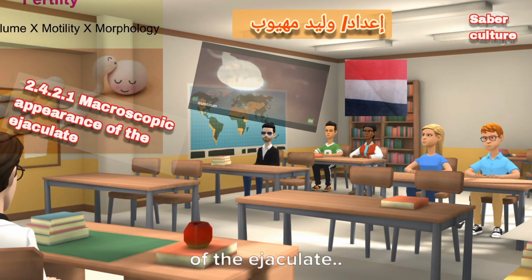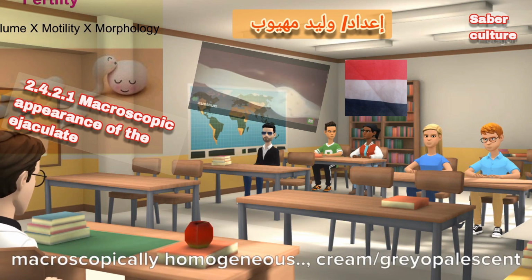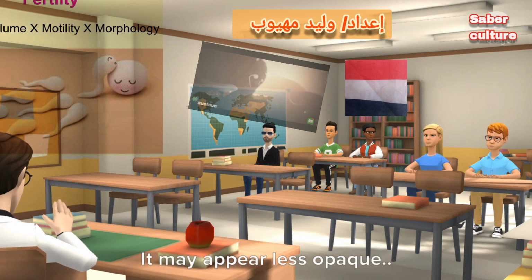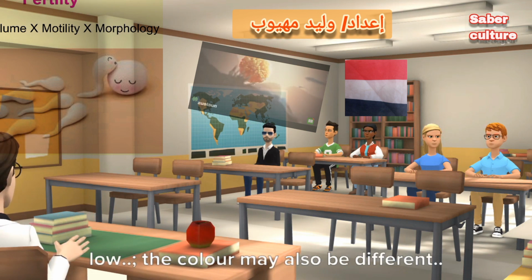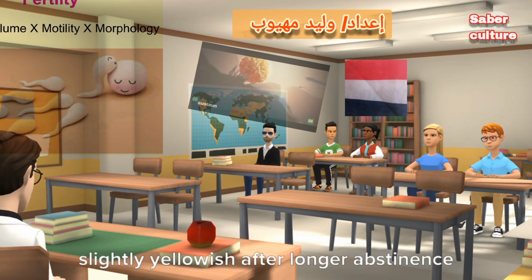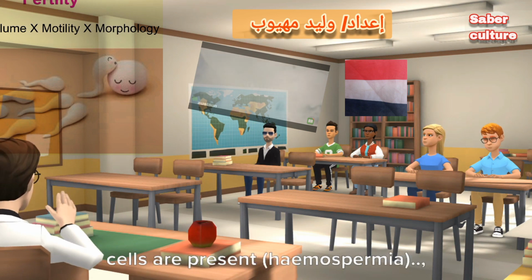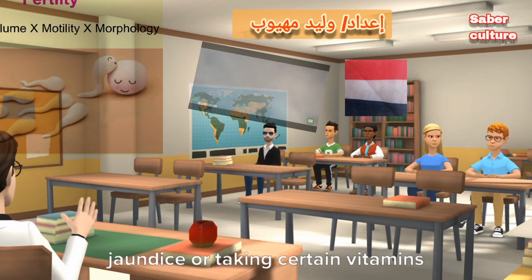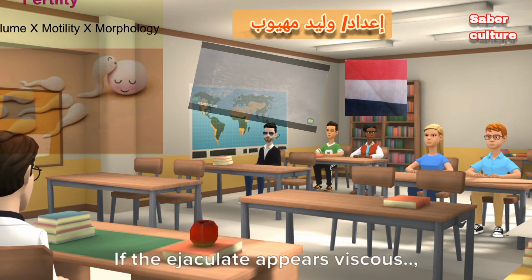2.4.2.1 Macroscopic appearance of the ejaculate. A normal liquefied ejaculate has a macroscopically homogeneous, cream/gray opalescent appearance. It may appear less opaque if the sperm concentration is very low. The color may also be different: slightly yellowish after longer abstinence times, red-brown when red blood cells are present, hemospermia, or clear yellow in a patient with jaundice or taking certain vitamins or drugs.